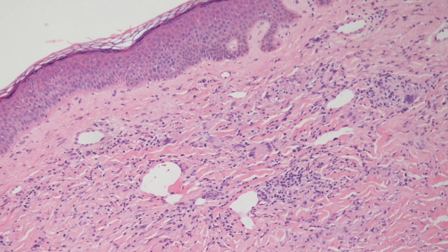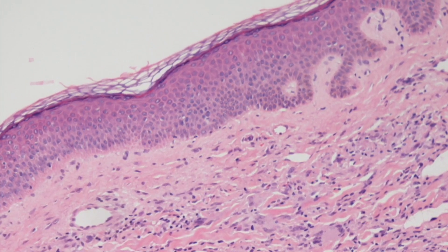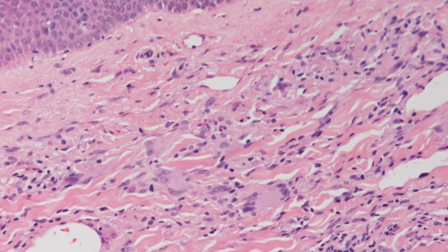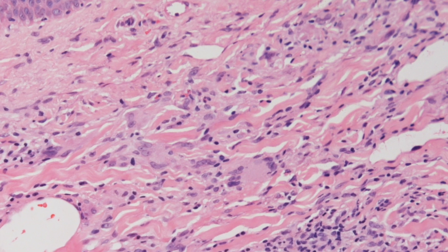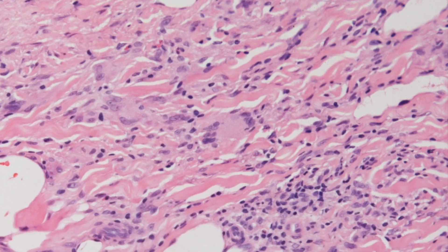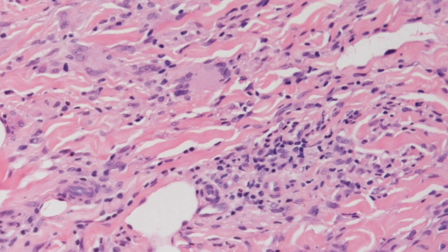In this biopsy of NLD, the overlying epidermis is normal. Here is a higher power view of the inflammatory infiltrate that is composed largely of lymphocytes and histiocytes with a sprinkling of giant cells.